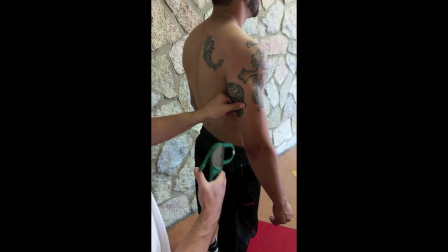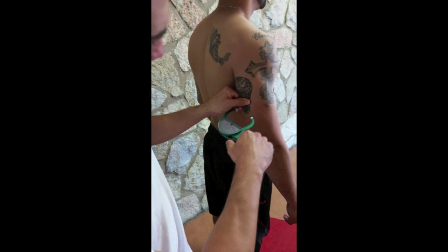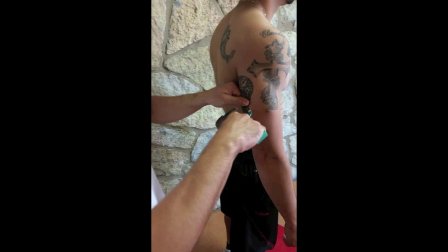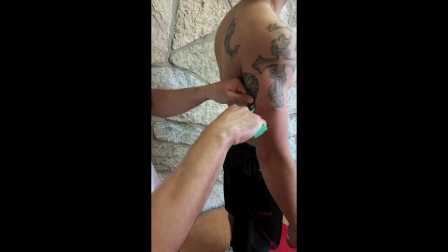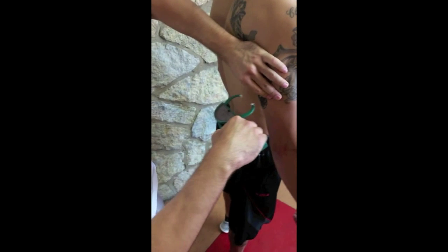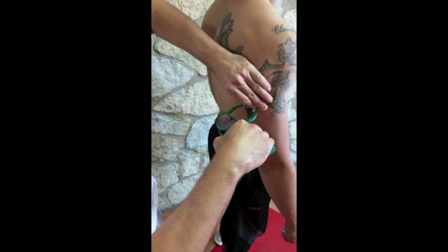the entire measurement. To measure the participant's triceps, you will engage in a vertical skin fold on the posterior midline of the upper arm, halfway between the acromion and the olecranon processes. The arm should be held freely to the side of the body.